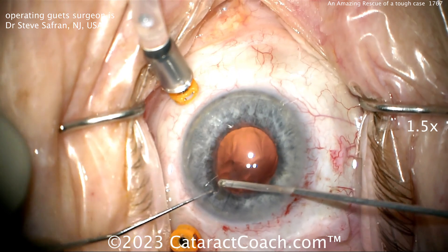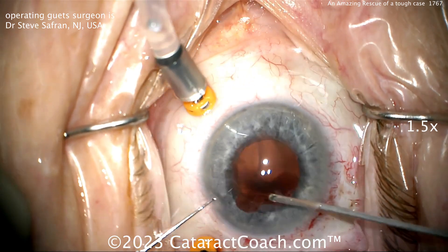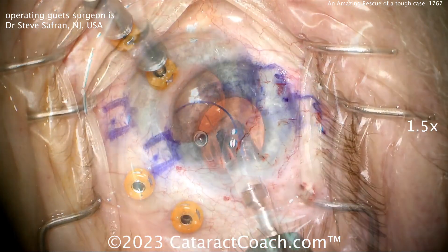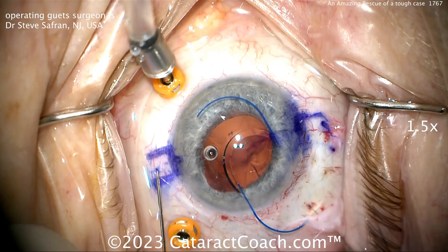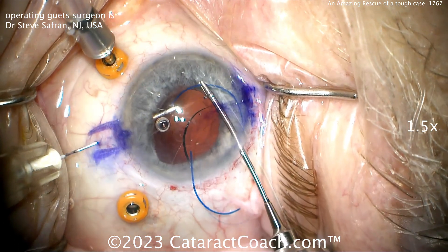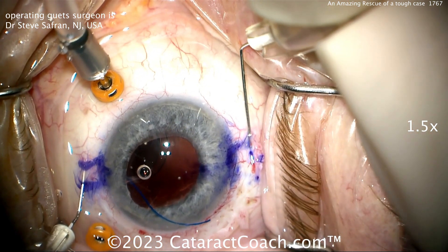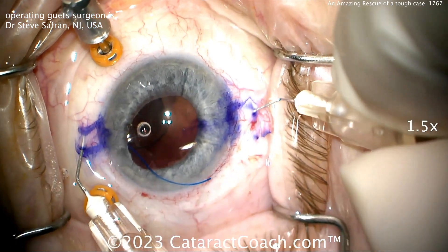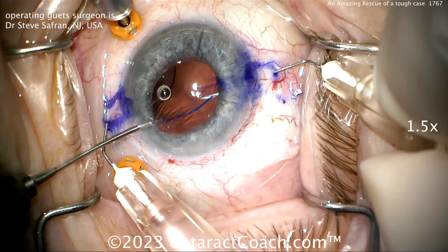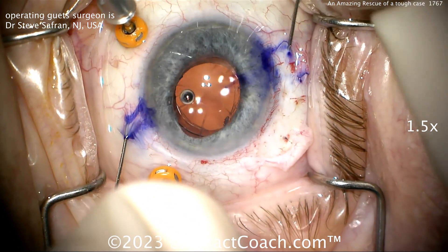Watch carefully — he's doing a little more cleanup with the vitrector, and inadvertently there's a little bite of the iris there, which will be addressed later. Now marking for the Yamane technique, about 2.2 to 2.5 millimeters posterior to the limbus, placing the 30-gauge thin-wall needles in at the appropriate angle, and now feeding through the special haptic. This is the Zeiss 602 lens, which has special haptics that are more resilient and less likely to break. Being very gentle feeding this in through the needle.